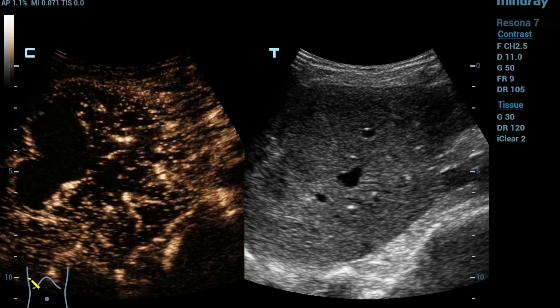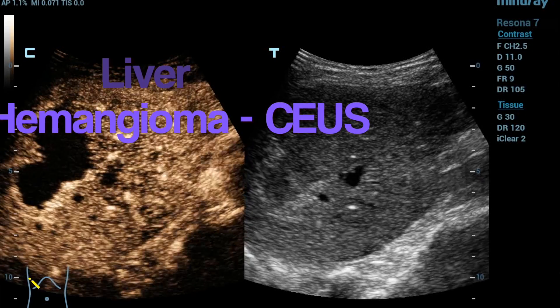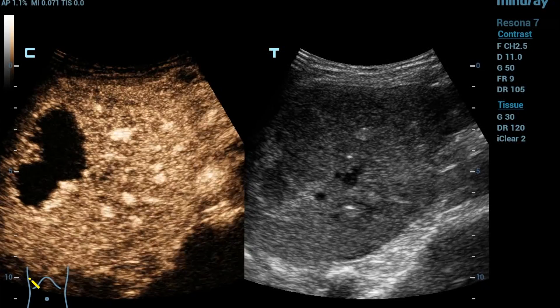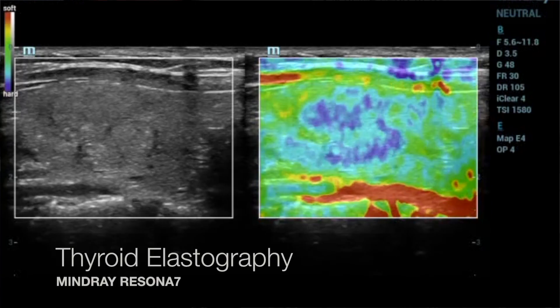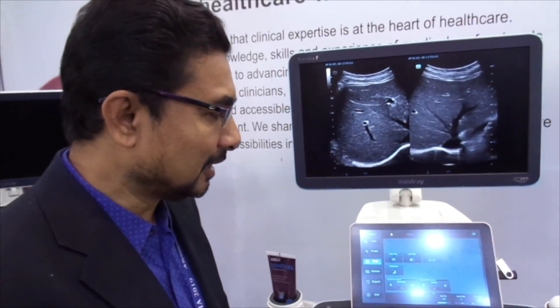The liver elastography has both STE and STQ modes. We have done it in a few patients and find it very useful. It produces an automated tabular column as a report at the end, which you can save and incorporate as part of your output quite easily.